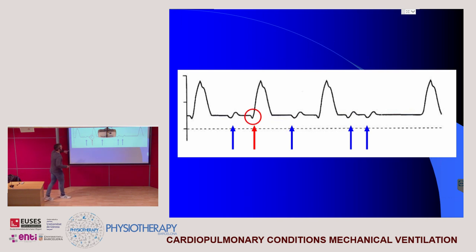So here we can see negative pressure and a predetermined cycle. So this is a set cycle. And here we will call that a spontaneous cycle. We can see that there is a negative pressure, so it's a little inspiration and a little expiration. Yeah, but it's a little one. You can see the difference between that one and that one, which is the set one, which is a normal breathing, and in fact there is a very low respiration effort. But we have to keep it, and we have to try to improve those efforts.